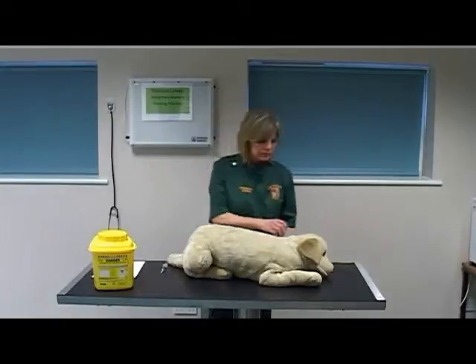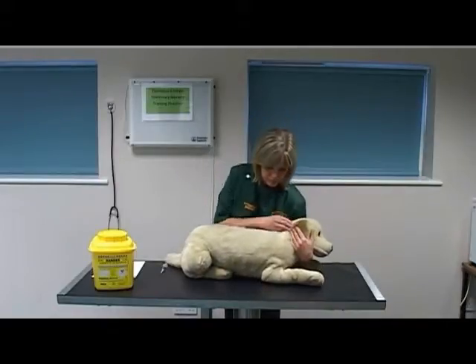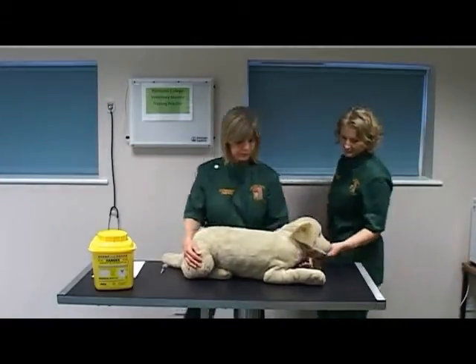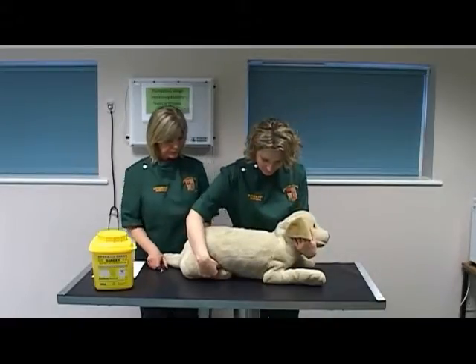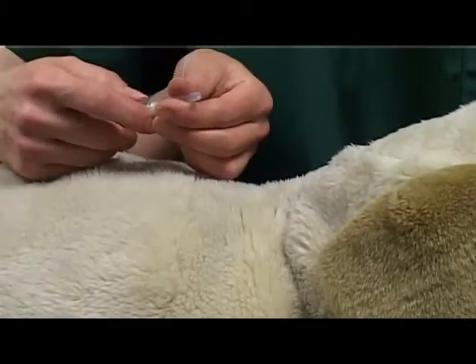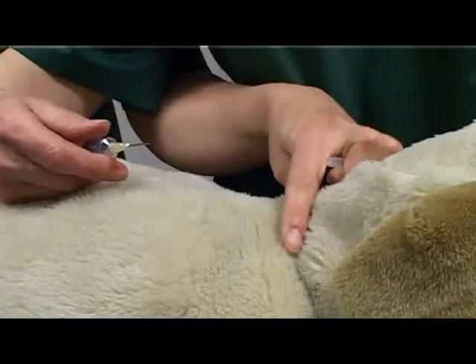Instruct an assistant how to restrain the dog effectively. Select the appropriate injection site — in this case, the scruff of the neck.